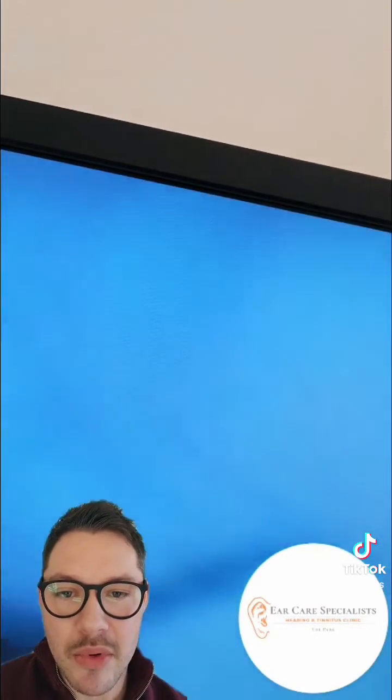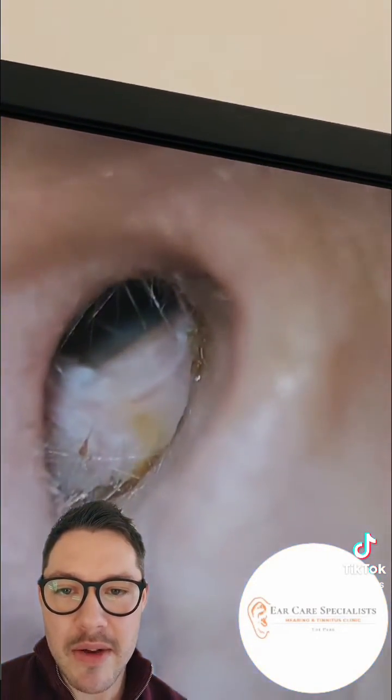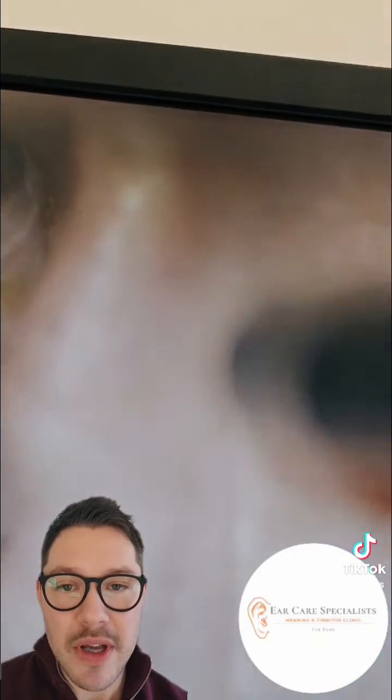You can see a big ball of the skin and wax come out of the ear there, and that's pretty much freed up the ear canal now, so the patient will be in a big relief and will start to hear much better. When you have big occluding chunks of wax in the ear, it will cause what's called a conductive hearing loss.